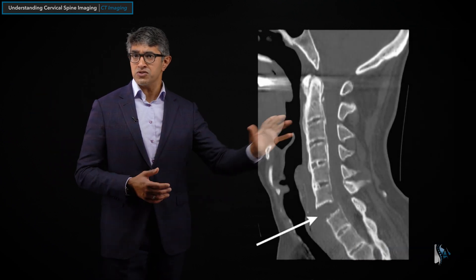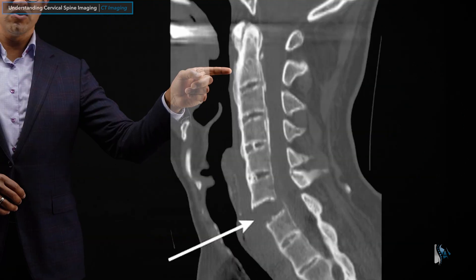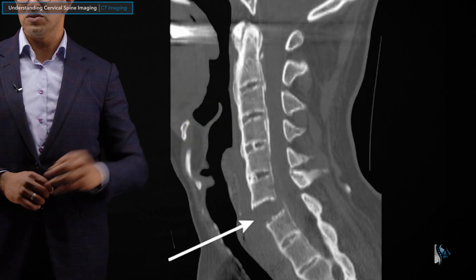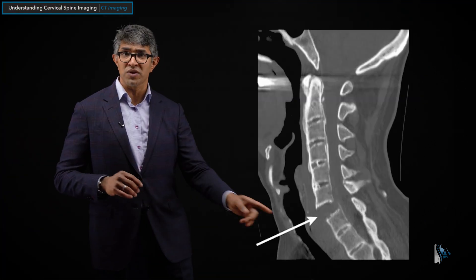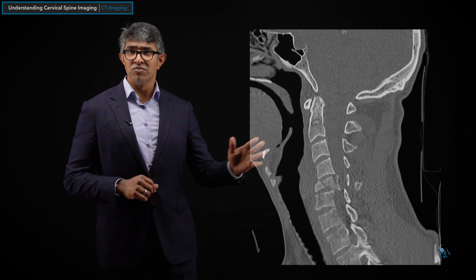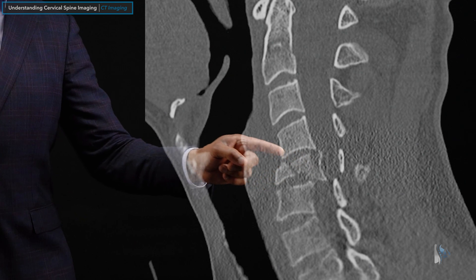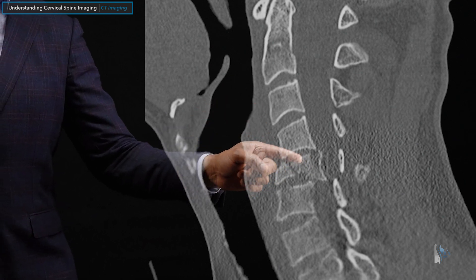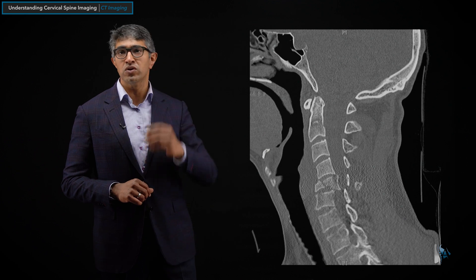Now, if you look at abnormal studies — here's a couple examples of abnormal pathology. Here's a sequence in somebody with ankylosing spondylitis. You can see these bones have all fused together — people have what they call colloquially a bamboo spine. It's very brittle, and somebody has a fracture right there; you can see that discontinuity — it's not normal. Similarly, this person had a fracture in the C5 vertebral body. The vertebral bodies themselves are normally rectangular in shape, but this one is fractured and parts of it are actually encroaching on the spinal canal, which can cause pretty severe spinal cord injury.